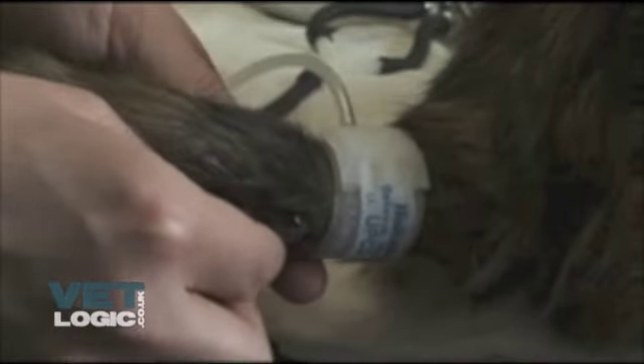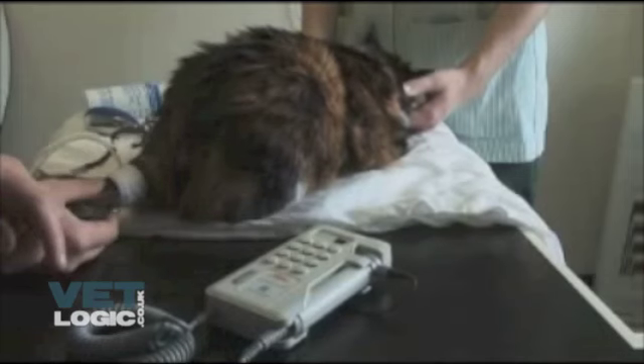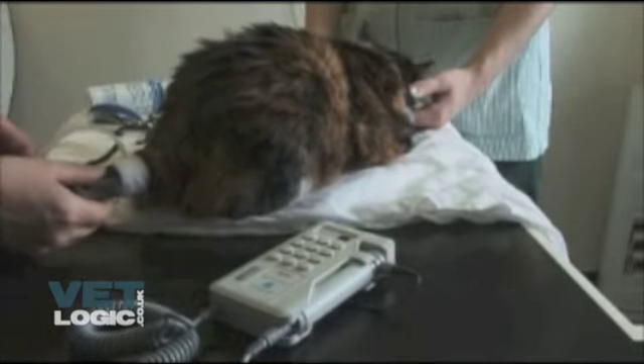The Doppler probe should be placed mid-line on the underside of the tail and slowly moved around this area if no pulse is found. The method of measurement is then the same as measuring systolic blood pressure on the forelimb.